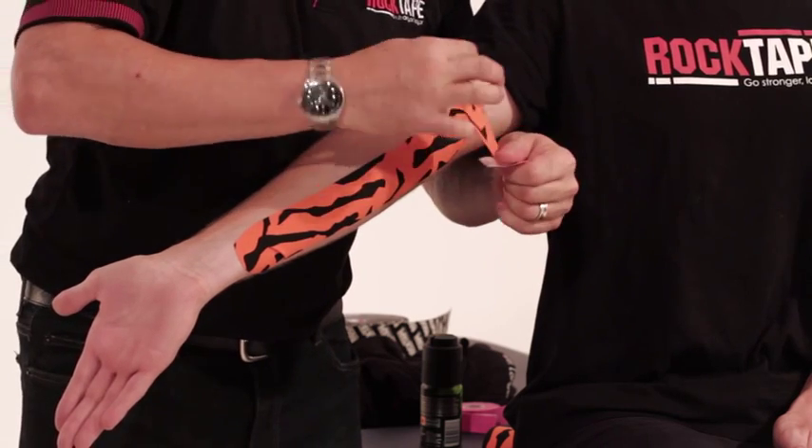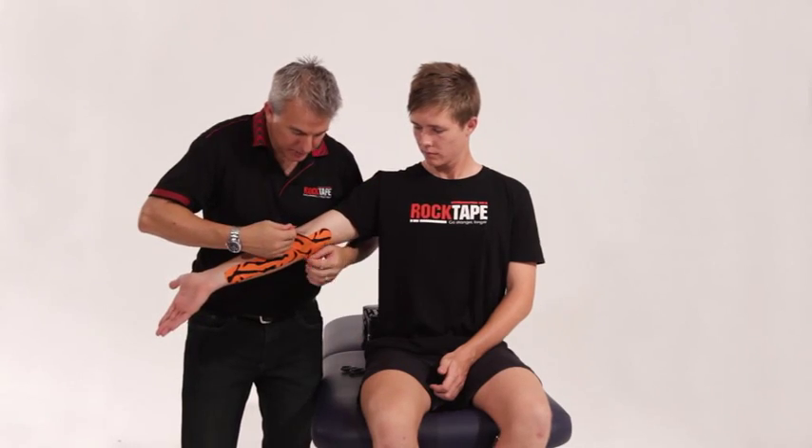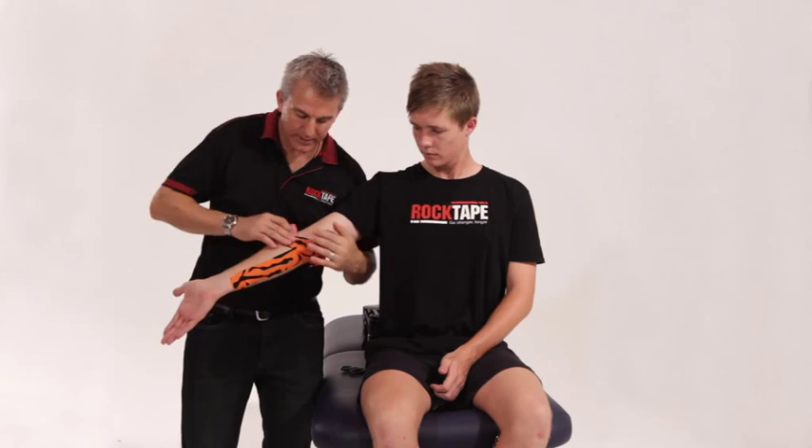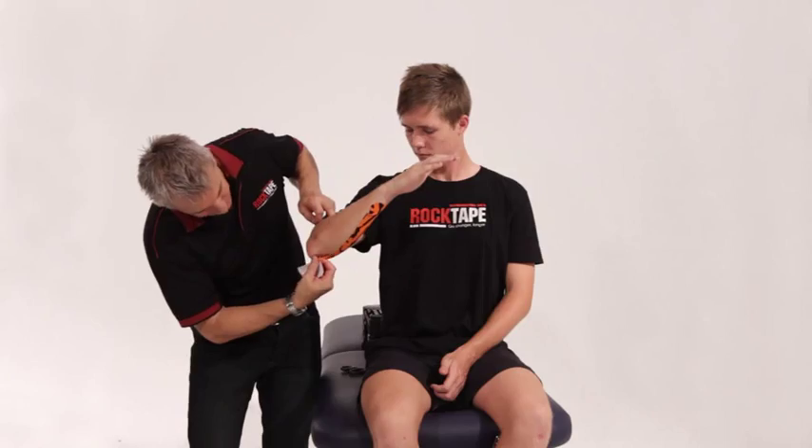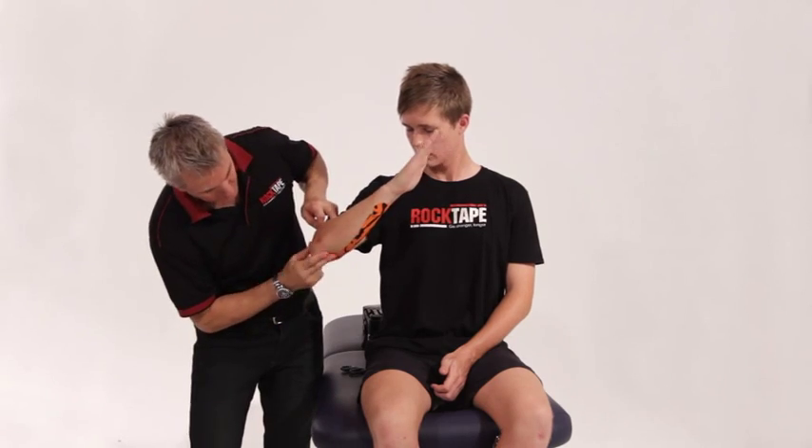What we'll do is just tape directly across, even on a little bit of an angle if you want. And as you do this part, you bend it around and over the elbow.